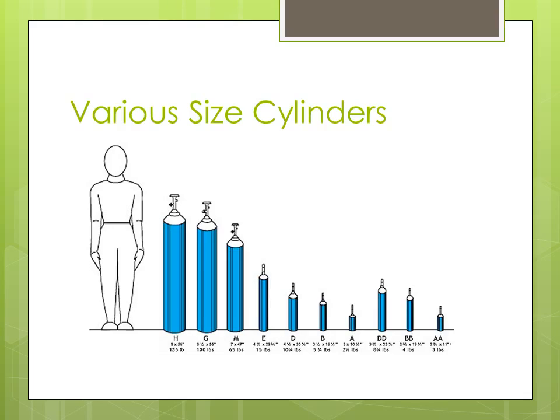You can have the empty cylinders in addition to that, but they have to be considered empty, and they have to be in a separate holding area that says empty. Now, are they truly always empty? Not necessarily. But that is the line that you walk, and that gets us into lots of trouble in lots of areas. The other thing about these cylinders, which is very critical to understand, is securing them. They have to be secure. They cannot be laying on their sides. They have to be properly secured. And we're going to look at a couple images on that in a minute.